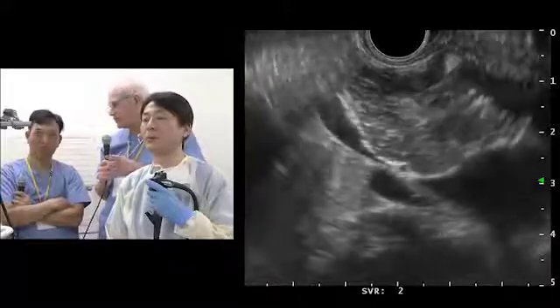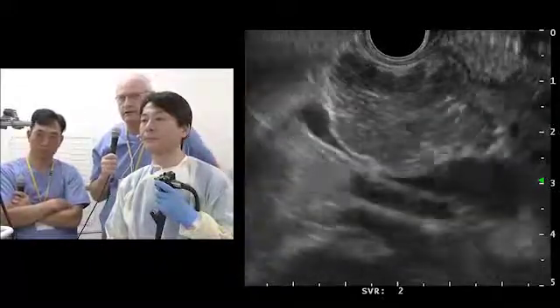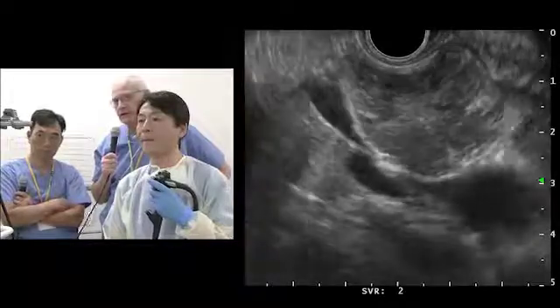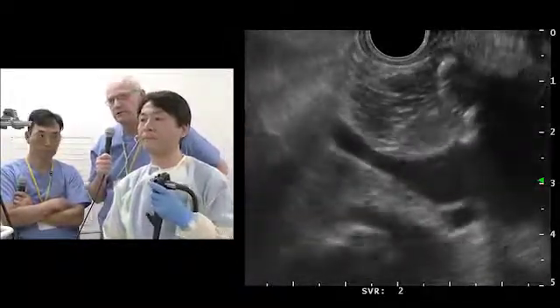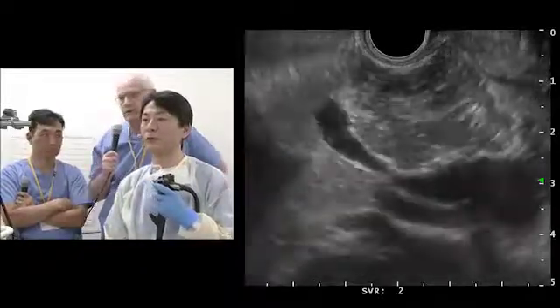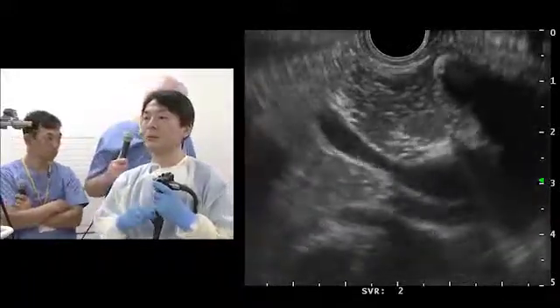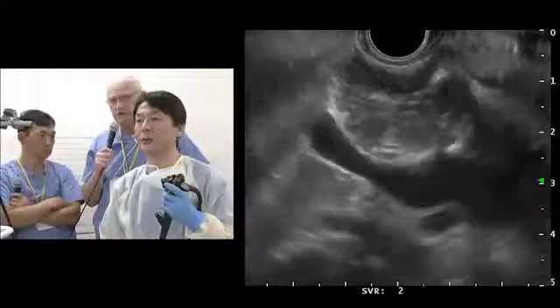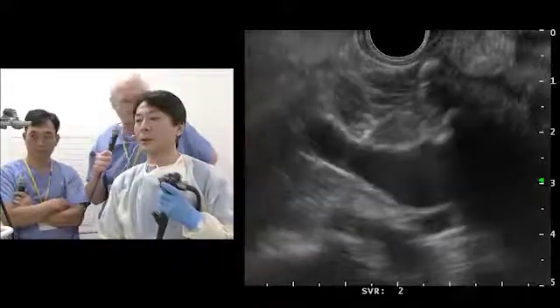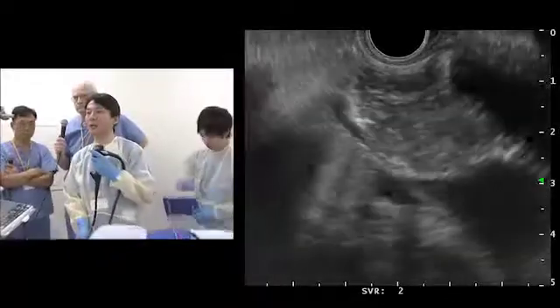We don't really know what this is, and so it may require extra tissue. It's known that the 22 gauge will get a higher volume of tissue. So I think a 22 gauge is probably what I would go with. I think a 19 is too stiff. So you've chosen a 22 gauge Olympus needle, which is a nitinol-based needle. Yes. It consists of coil sheaths, so the movability is better, I think.